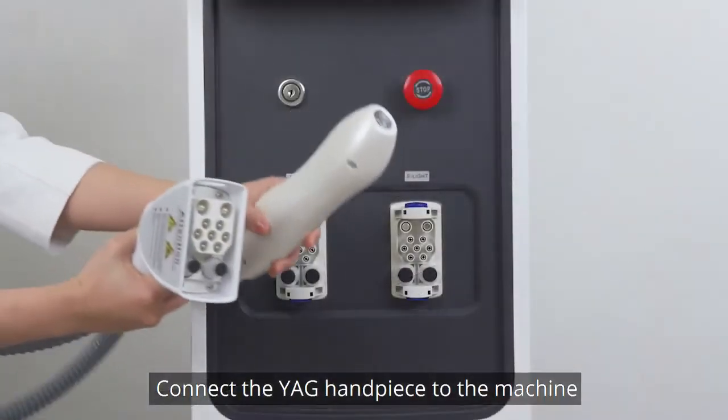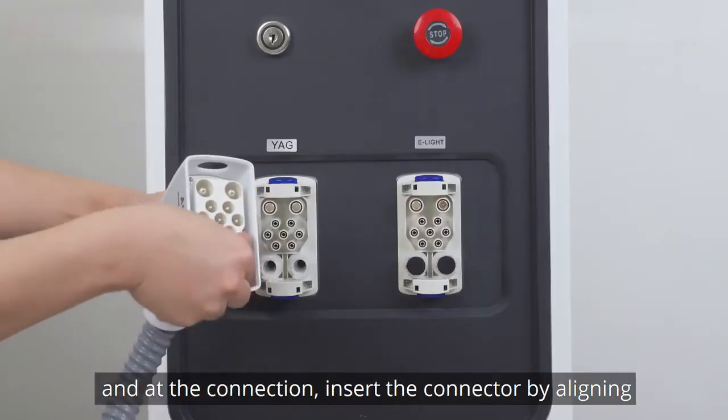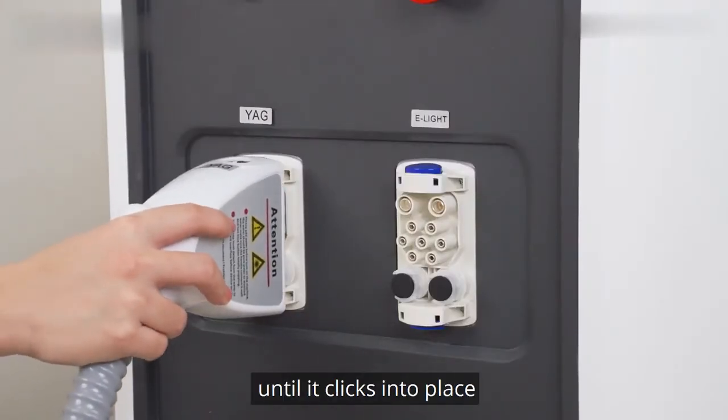Connect the YAG handpiece to the machine. Remove the black rubber caps on the connector and at the connection. Insert the connector — aligned with the small holes — and push the connection until it clicks into place.